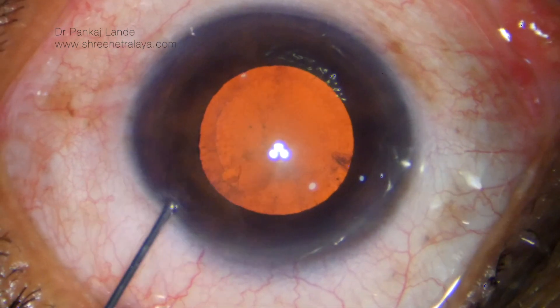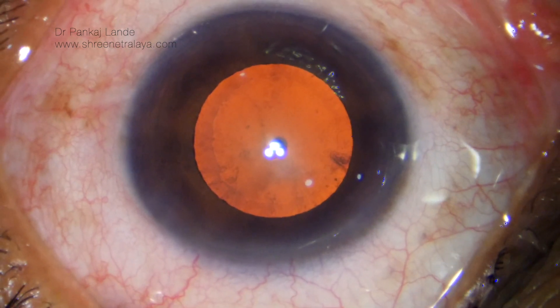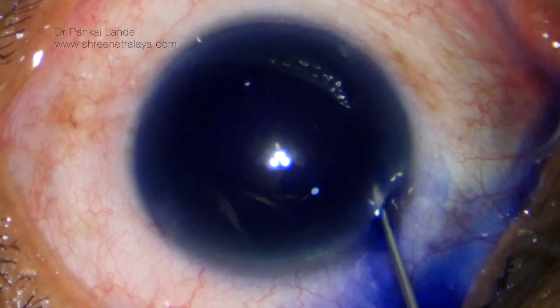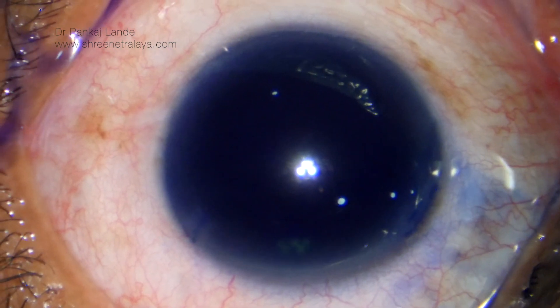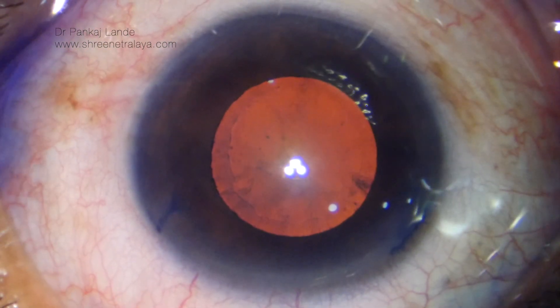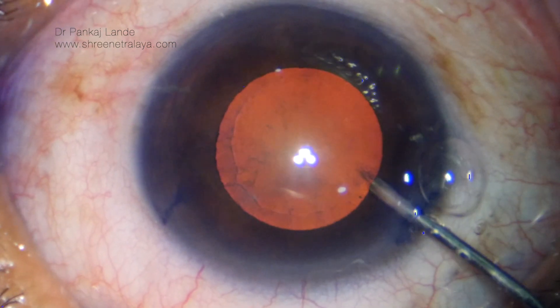You can see there is pseudo-exfoliative material on the anterior capsule. Intracameral adrenaline was tried but was ineffective. This is followed by a stain with trypan blue for 30 seconds, followed by a wash with saline.